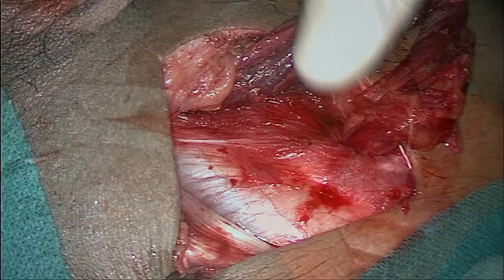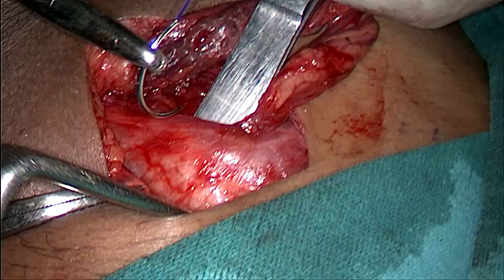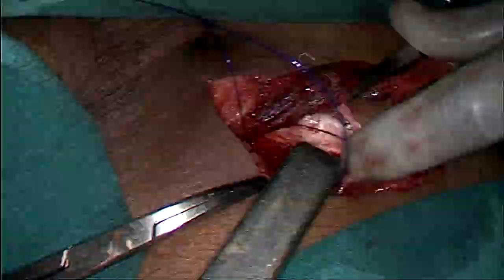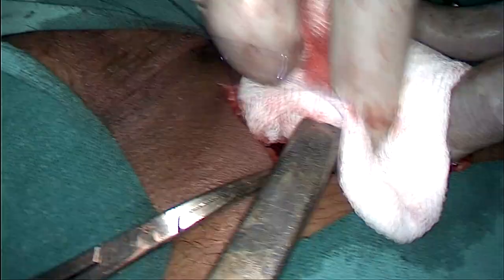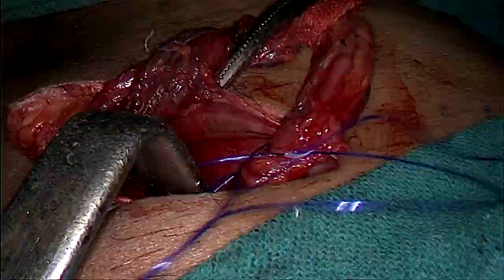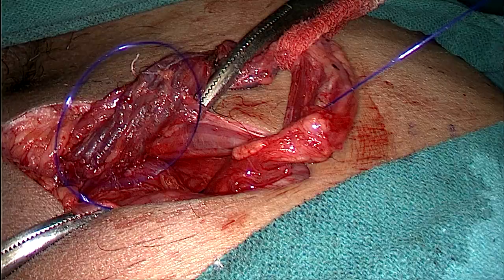Hope you can appreciate the fibers from the conjoint tendon very clearly. Now we are taking a bite of the conjoint tendon and start repairing it with the lower lip of the external oblique aponeurosis on the lateral side. Try to take a good bite while repairing the posterior wall and avoid taking the external oblique aponeurosis. By tying this knot we just create a new deep inguinal ring.